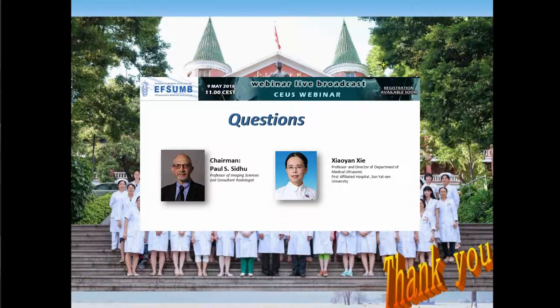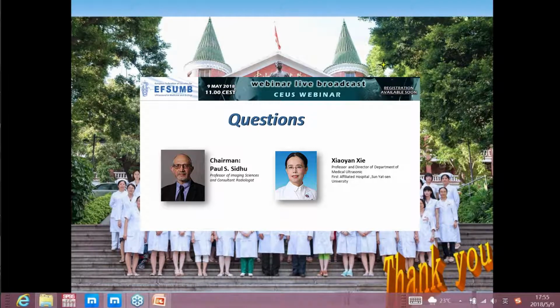Professor Liang, this is a question for you as well. Do you have any tricks or tips for improving 3D? Yes, but only a few cases used 3D to evaluate the therapeutic effect after thermal ablation, so not so much experience. The technology is still not quite sufficient to make it easy to use yet. We can do the scanning, but the scanning is not easy.